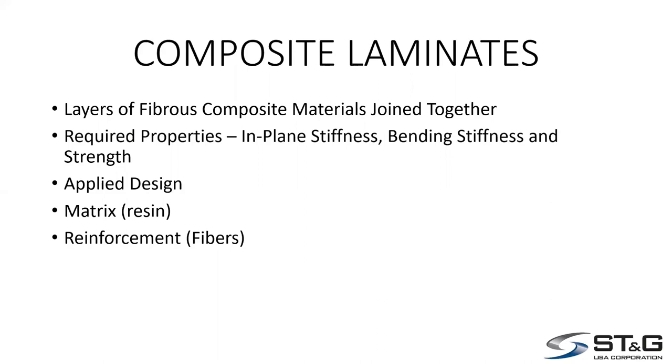So if we think of carbon fiber, when you laminate it, it automatically becomes stiff. The interesting point is these days there are discussions around soft sockets, flexible sockets, or really rigid sockets. And there are a lot of variations in thoughts. Some people like more flexible, some people really like the stiff socket. And then you have everything in between. So some of these things we need to think about when we're applying a design.